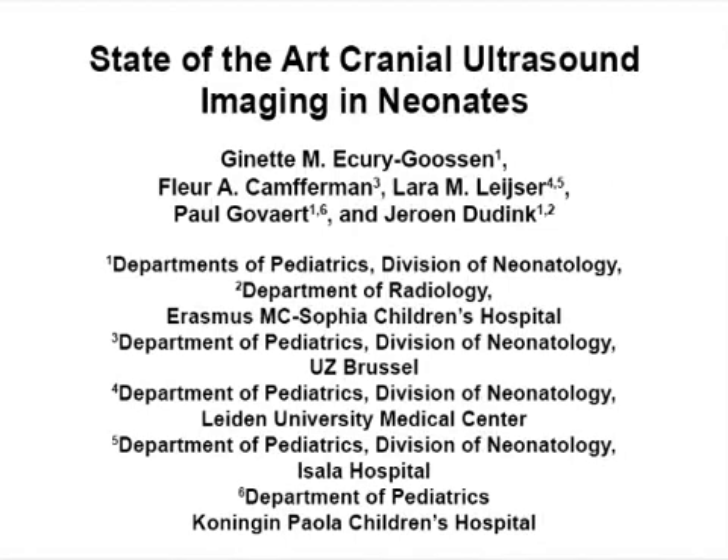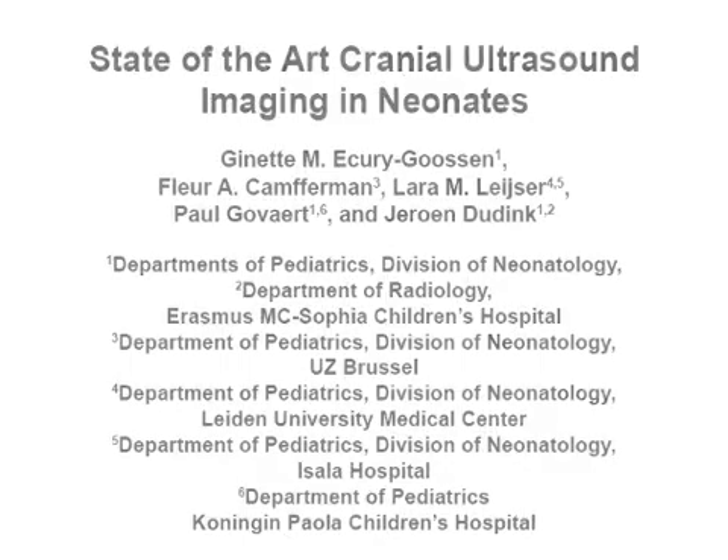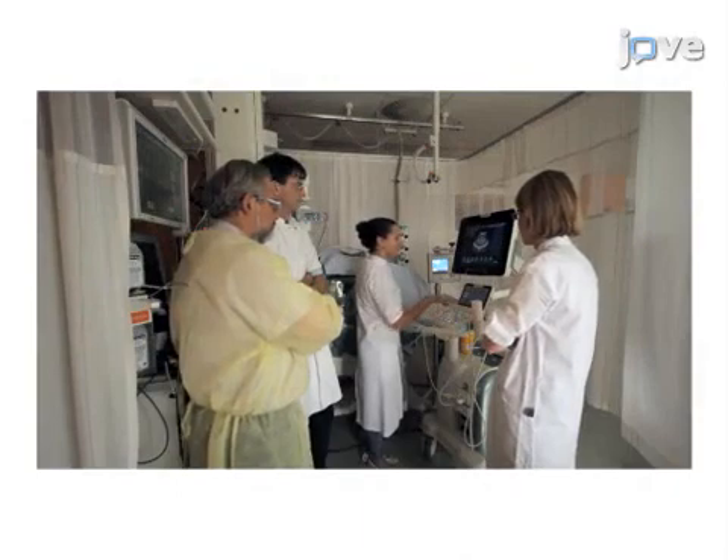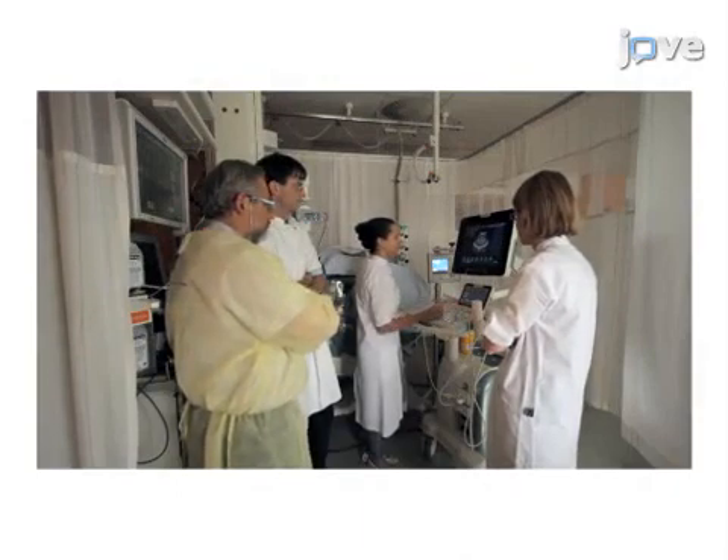The overall goal of this procedure is to demonstrate a state-of-the-art neonatal cranial ultrasound technique. We will focus on the use of different transducers, multiple acoustic windows, and Doppler techniques.